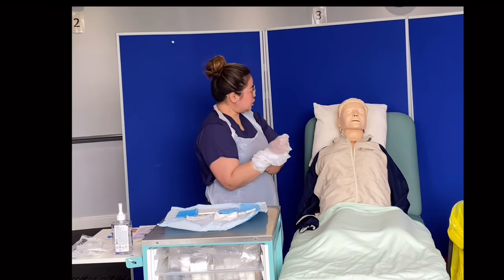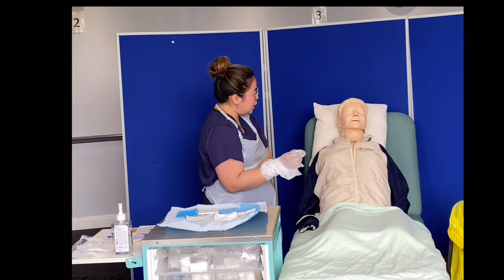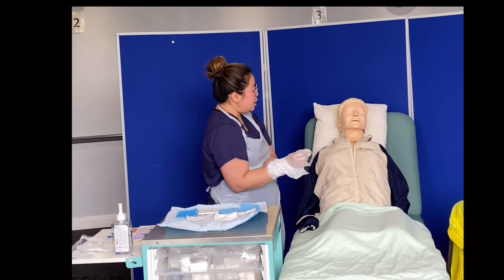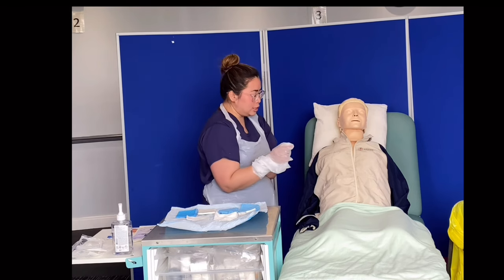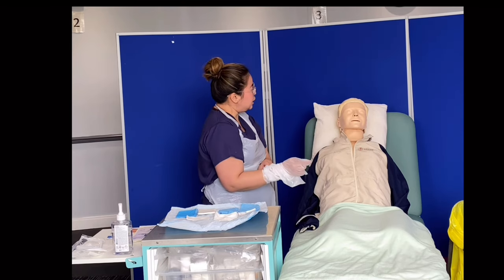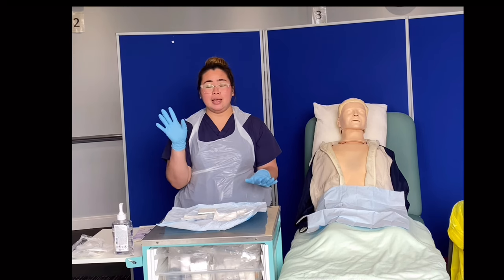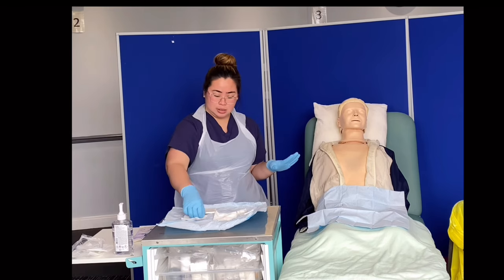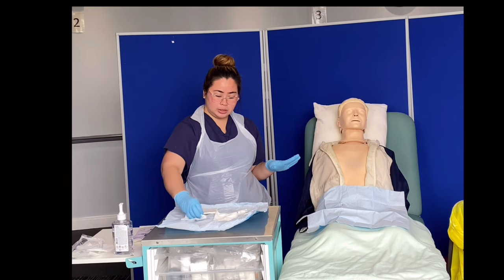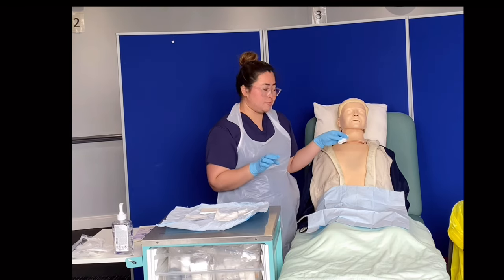So Joe, I've got my materials quite ready. Before we proceed, I just wanted to remove the dressing on your abdomen and assess how your wound is looking. Will you be able to open up your top for me so I can quickly access it? I will ensure that the blankets are on top of you at the bottom to still maintain your privacy. Is that okay? Of course. Perfect, thank you. So before I clean the wound, I will designate my right hand as the clean hand and my left hand as the dirty hand, which will be cleaning the abdominal wound. I will get a swab and clean it with one stroke and discard until it's visibly clean.